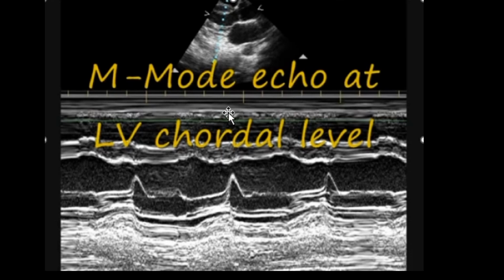This is the movement of the right ventricular anterior wall. Chest wall will be here, and this is the posterior left ventricular wall. You can see that it becomes closer together. Septum moves towards the left ventricular cavity, and posterior wall moves towards the left ventricular cavity in systole. And in diastole, it is the other way around. This is diastole. Ventricle relaxes and expands.